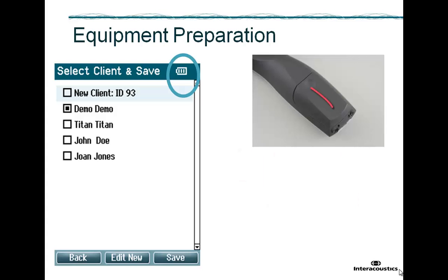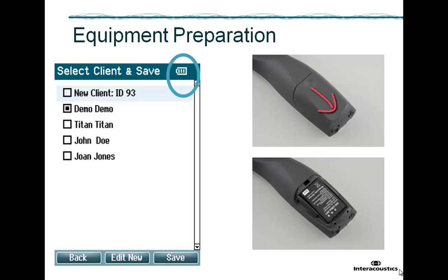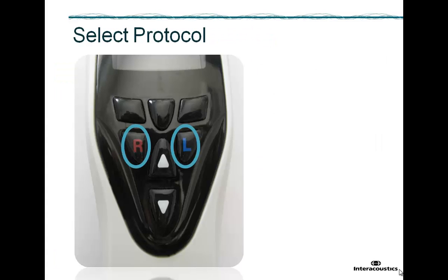To replace the battery, slide down the battery lid, remove the battery, and place a charged battery in the compartment — note that it only fits with the contacts in the correct position. Slide the battery lid back into place.